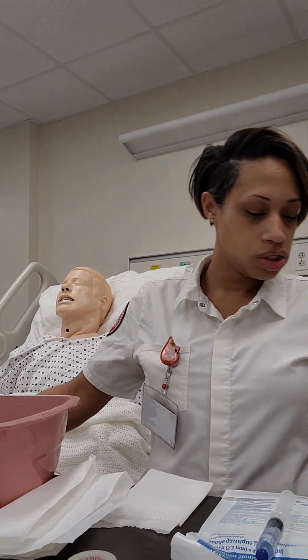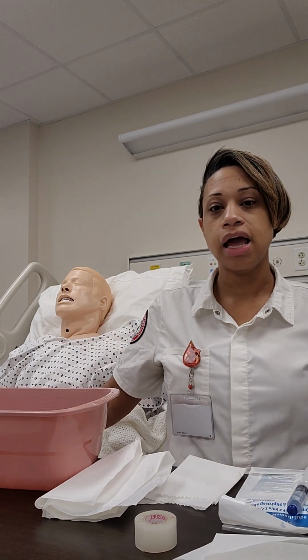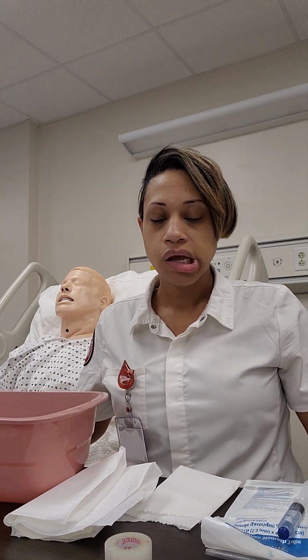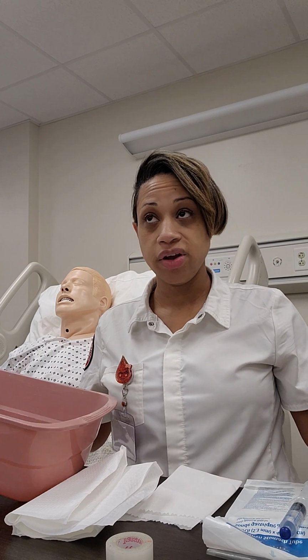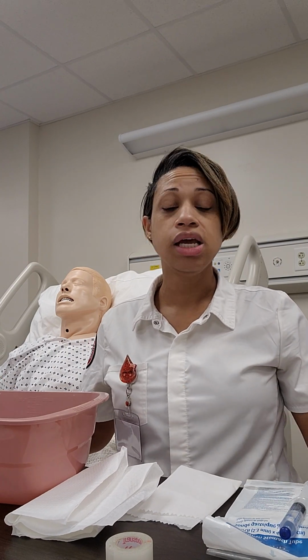Okay, I'm going to do NG tube placement. The first thing that I am going to do is identify my patient orders. Once I identify my patient orders, I will verify my patient's doctor's orders. I would identify my patient.